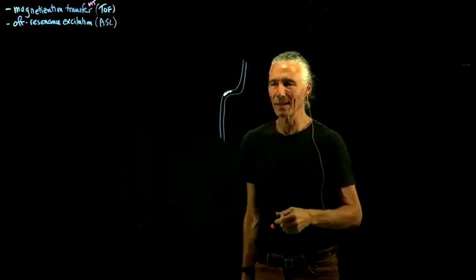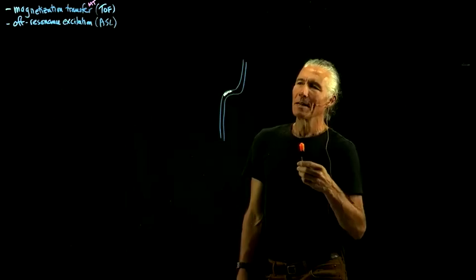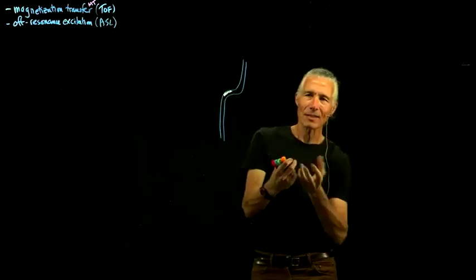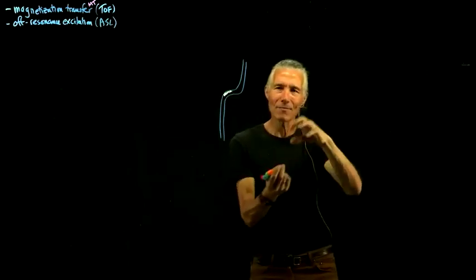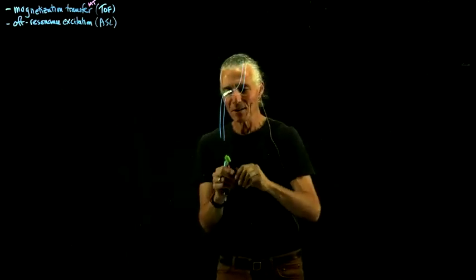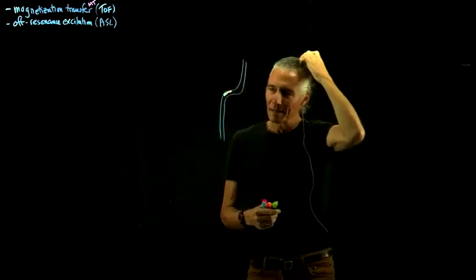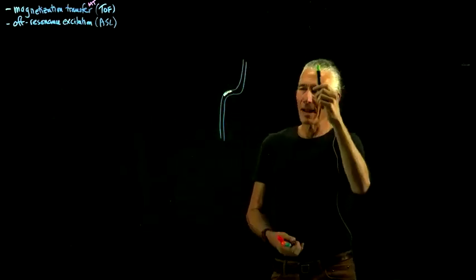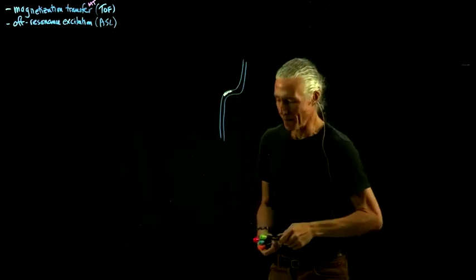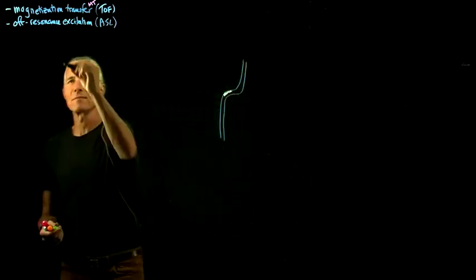Not a big excess, 1 in 10,000, something like that. But if you think about that, they're lined up in spite of the fact that the molecule they're in is bouncing around, bouncing off the walls, and they're just sitting there like, I'm lined up. And then those molecules flow into the head, and they'll have extra longitudinal magnetization. And so when you do an RF pulse, you get a nice big signal out of them. So that's basically the principle of time of flight, TOF.